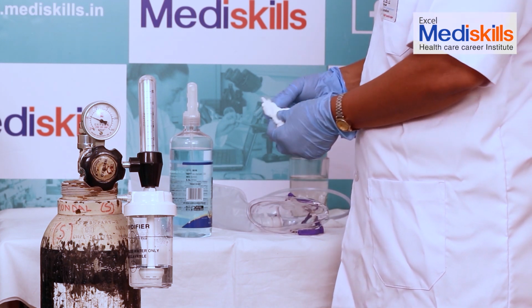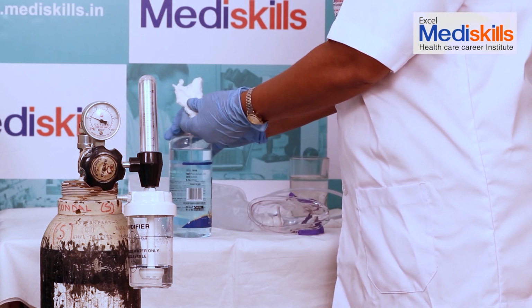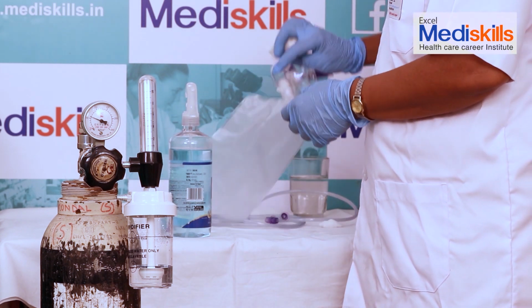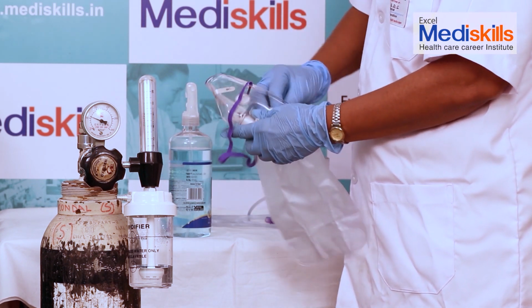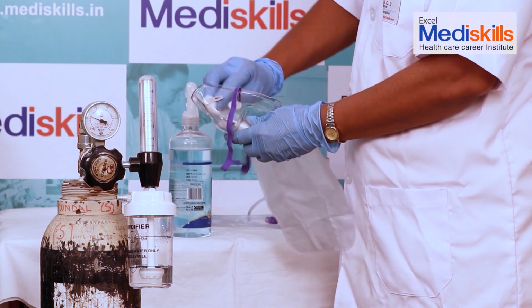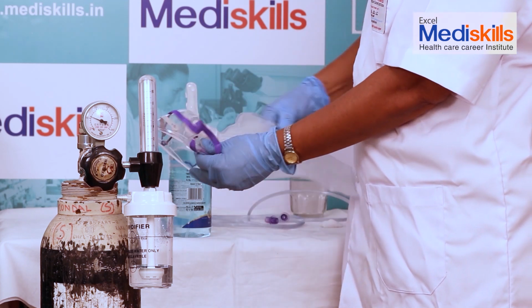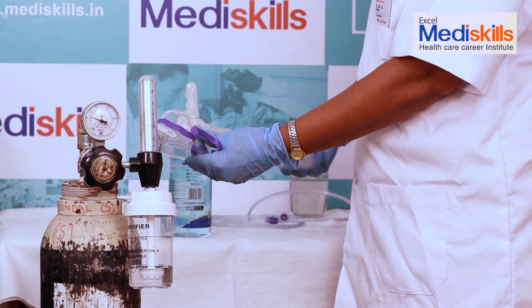First, I take cotton and then make it ready with alcohol. Then we first clean the bag mask. This is to be attached to the patient's mouth. Then in the back portion, the upper side has to be disinfected properly.